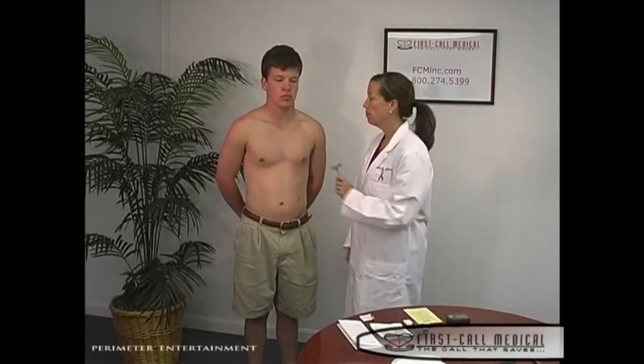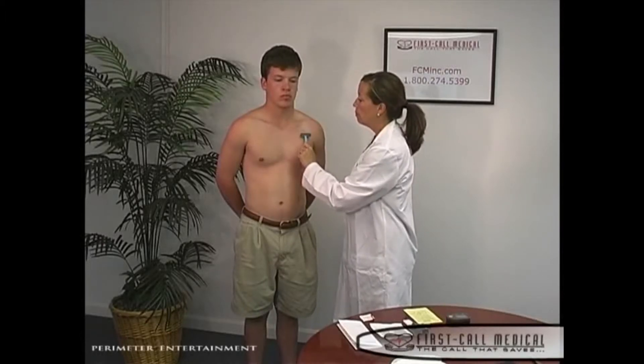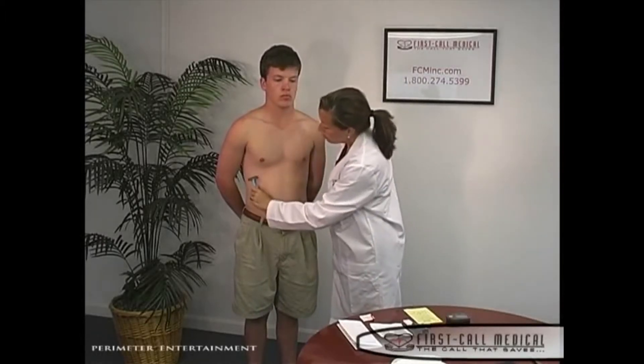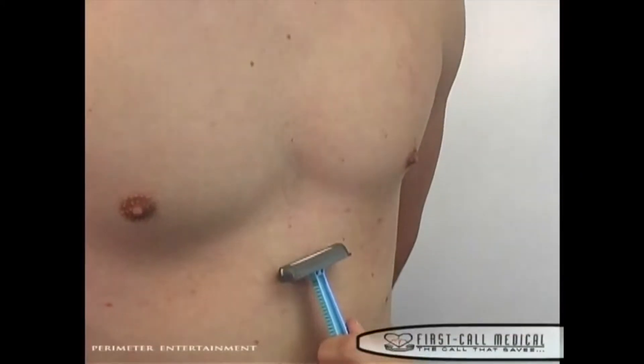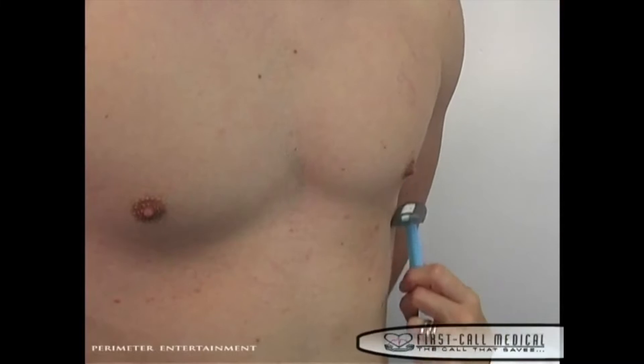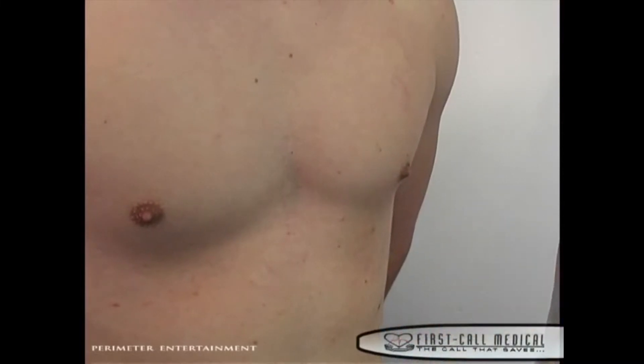To get started, proper skin preparation is essential to a successful holter hookup. For some men, shaving the five locations for the electrode patches is necessary. Following the yellow diagram included in your holter hookup kit, please shave an area 3 inches by 3 inches for each location. Try to avoid scar tissue or wound areas for electrode placement.